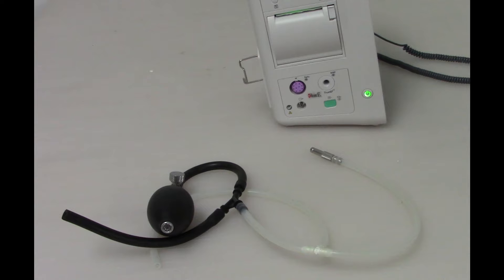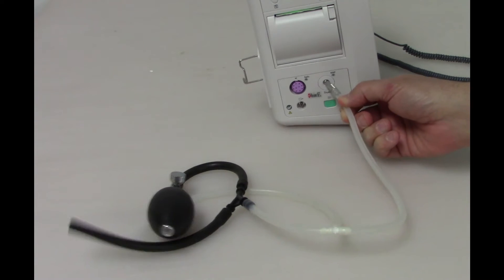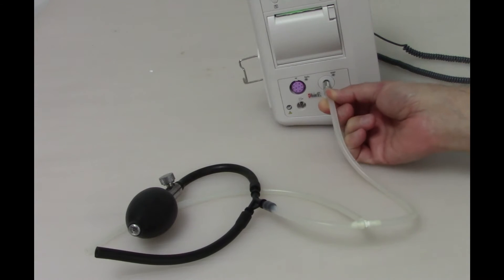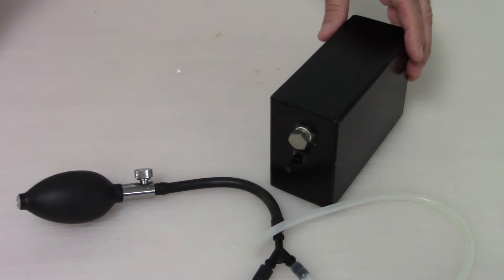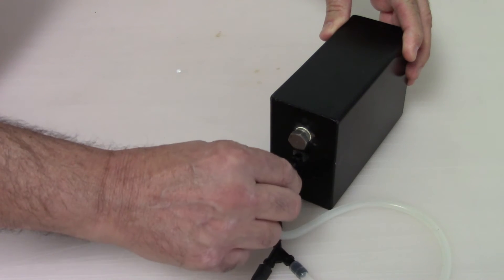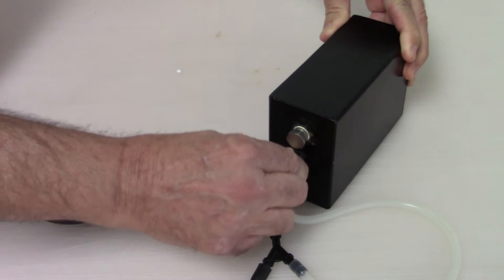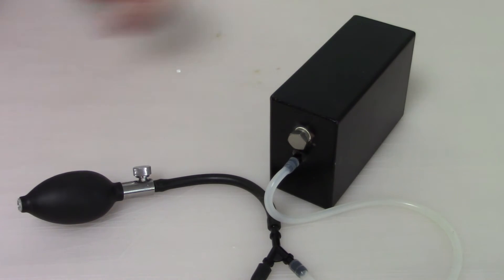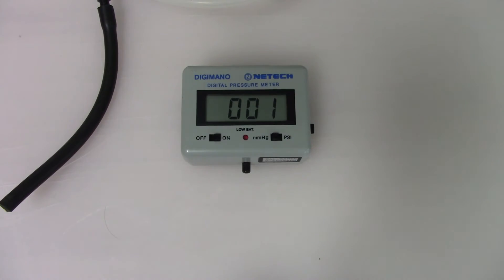Connect the squeeze bulb to the VS9 monitor using the NIBP connector. Connect the rigid vessel to the squeeze bulb. Connect the manometer to the squeeze bulb.